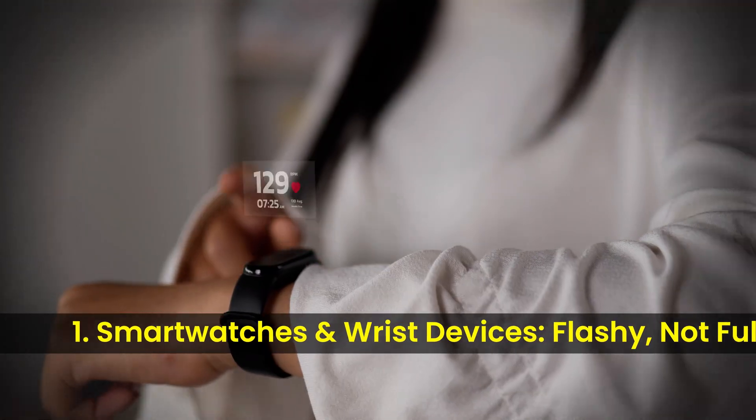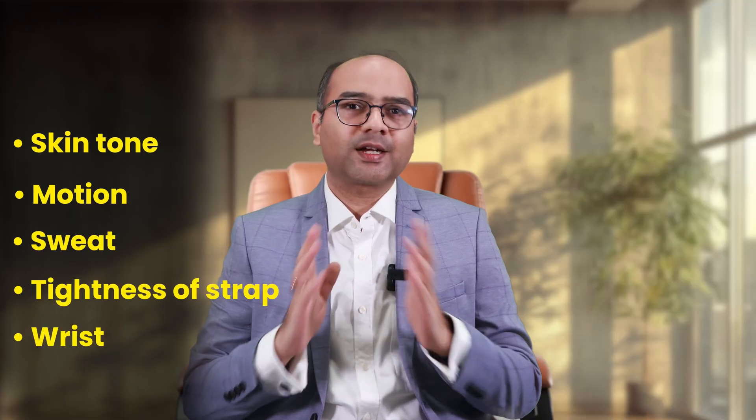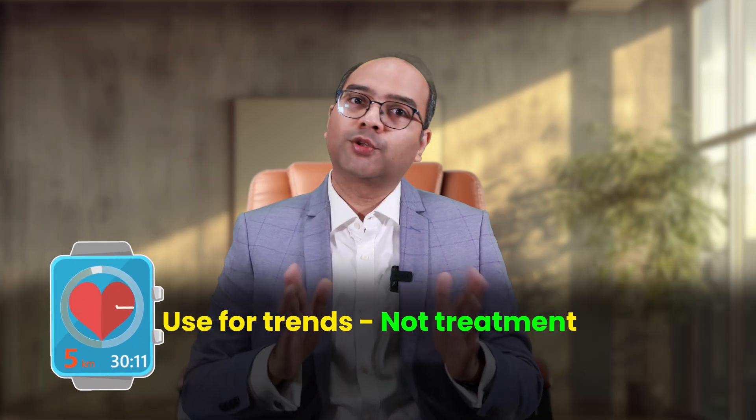First are the smartwatches and wrist devices — they are flashy but not fully trustworthy. Smartwatches measure your blood pressure using optical sensors based on light reflection and pulse wave analysis. Sounds smart, but here's the catch: they are easily affected by your skin tone, motion, sweat, the tightness of the strap, and the wrist artery anatomy. That's why these readings can vary significantly — they are not validated and not recommended.